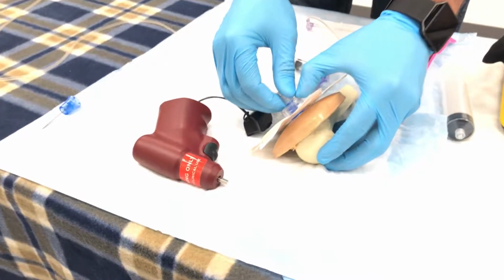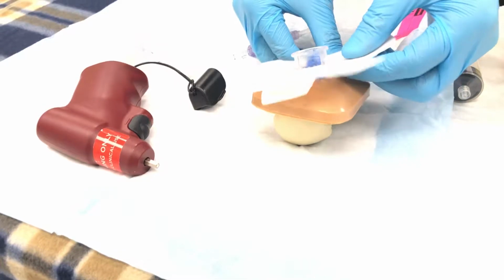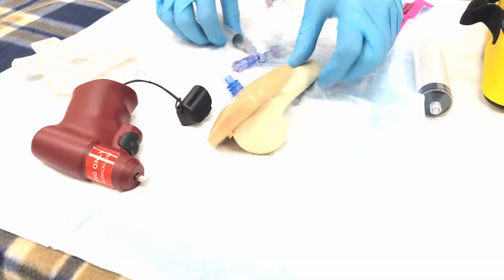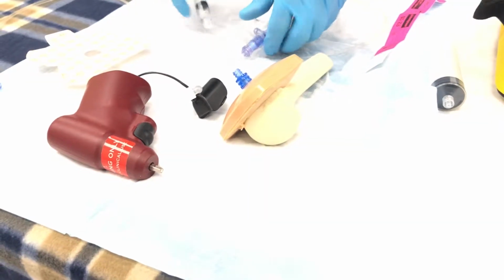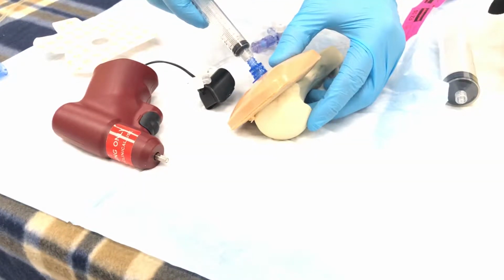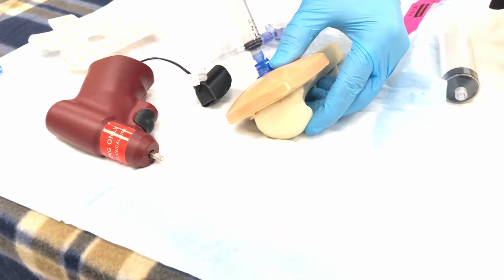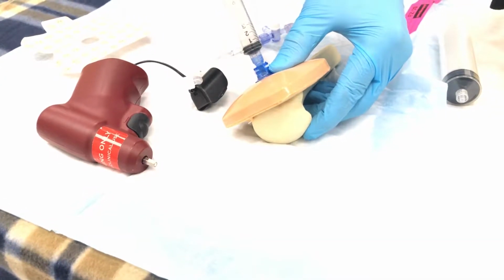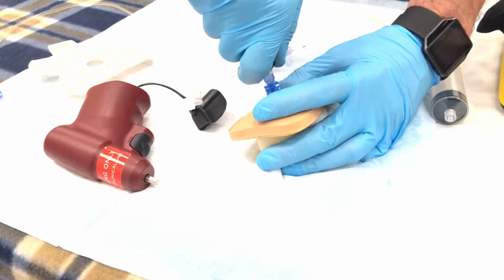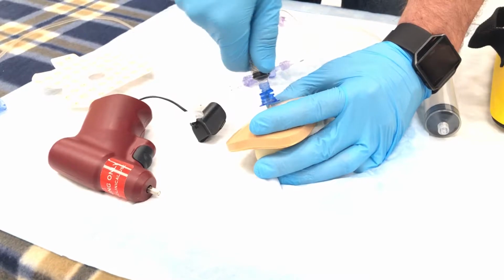Intraosseous removal. Remove the extension set from the end of the IO and the adhesive dressing securing the IO. Attach a Luer lock syringe to the hub of IO catheter. Withdraw the IO catheter by applying traction while rotating the syringe and catheter clockwise. Maintain axial alignment during removal. Do not rock or bend the intraosseous catheter.